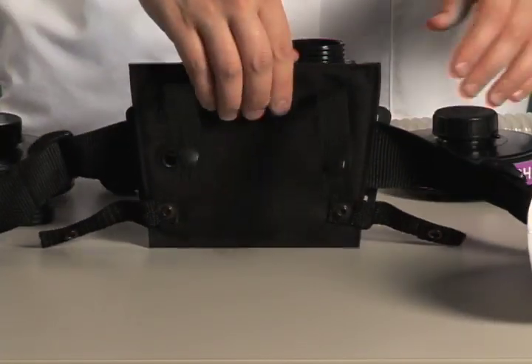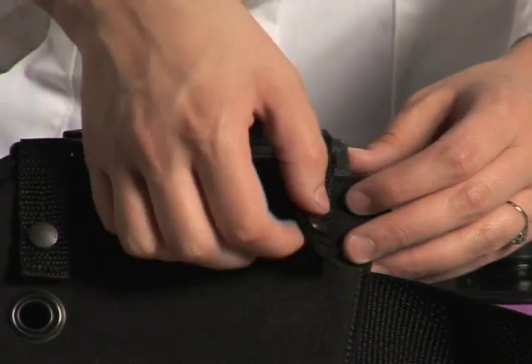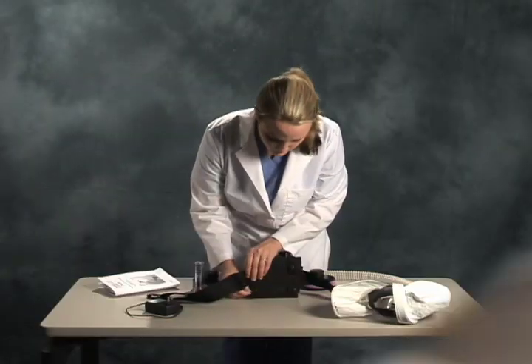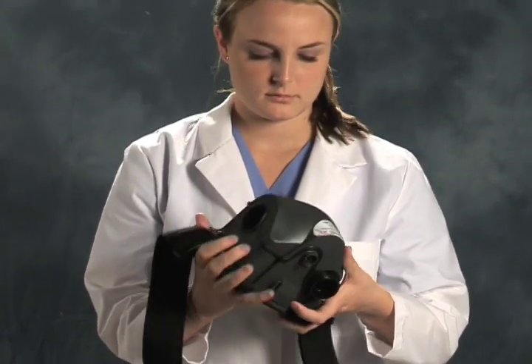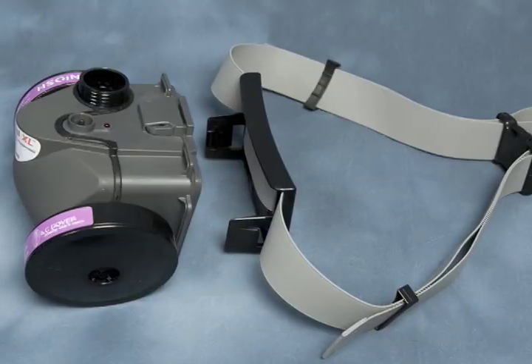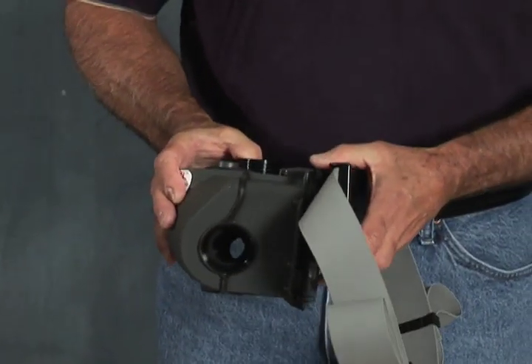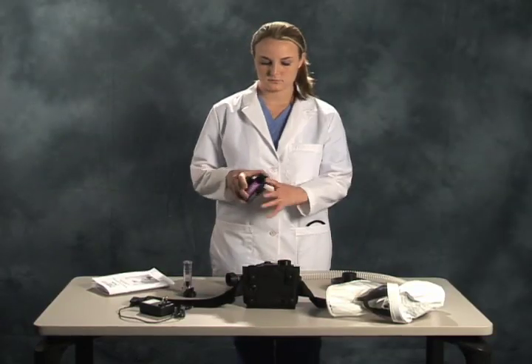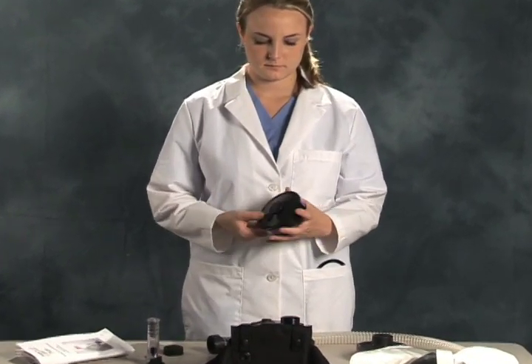To ready the blower for use, integrate the blower to the waist belt. In addition to the fabric belt, a Quick-Lock belt is also available which simplifies blower attachment and eases belt cleaning. Next, attach the HEPA cartridges by removing the filter plugs and then threading them into the blower.